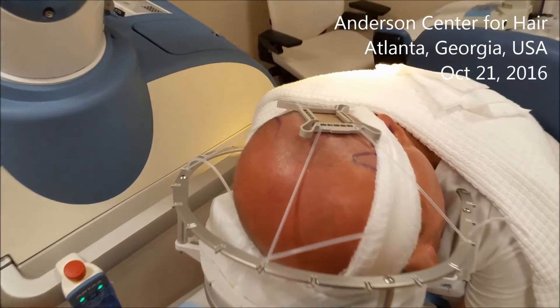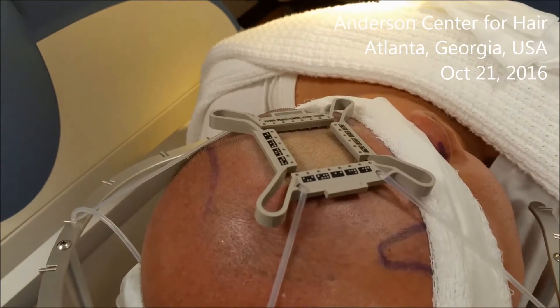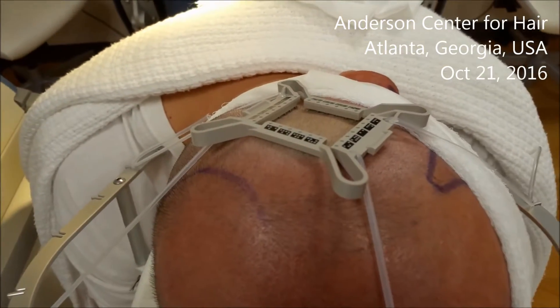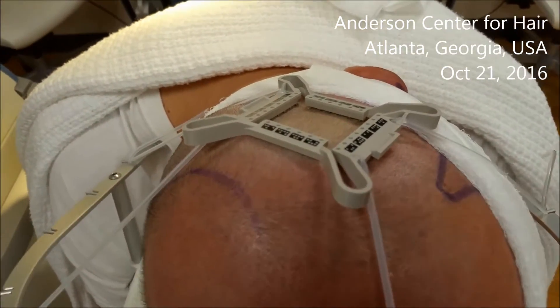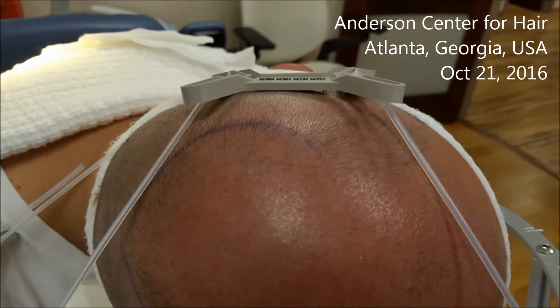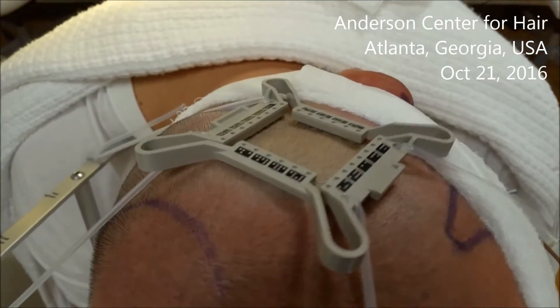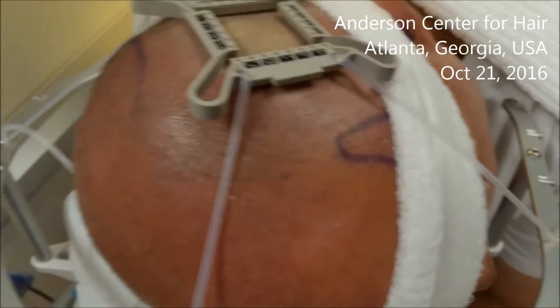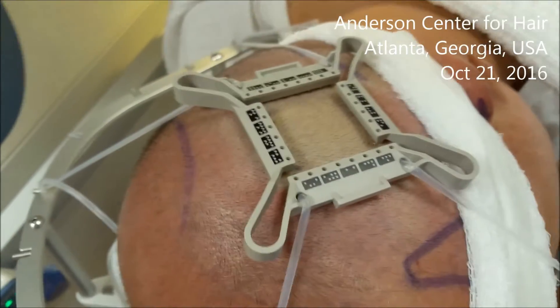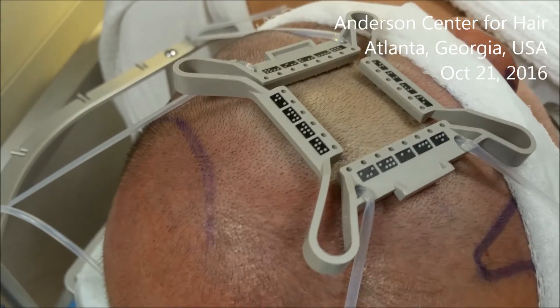I wanted to make a comment about what makes a successful robotic surgical case. That really starts out with tensioner placement. One of the first principles is achieving a planar surface with the tensioner and also achieving tension. You can see that the skin on the inside of the tensioner is blanched and lighter in color than the skin on the outside of the tensioner.